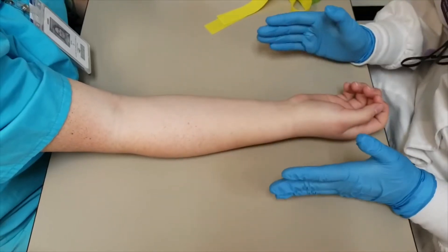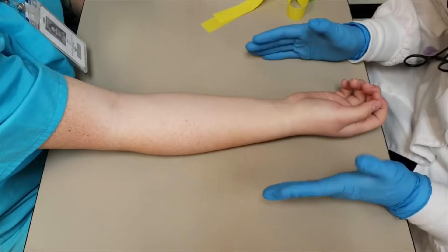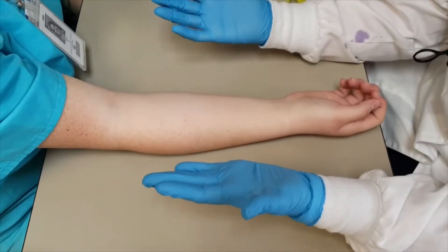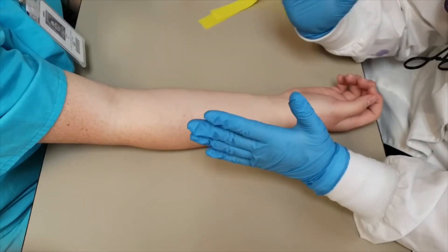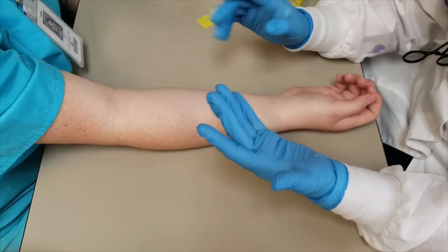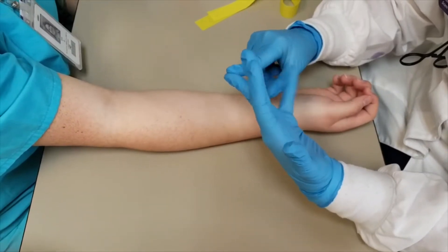How to perform phlebotomy correctly. First things first, make sure you have your PPE on, which is your gloves, your lab coat, and protective eyewear. And then the next thing you're going to do is identify your patient in front of you. You need to make sure you have their full name and their birth date as identifiers.